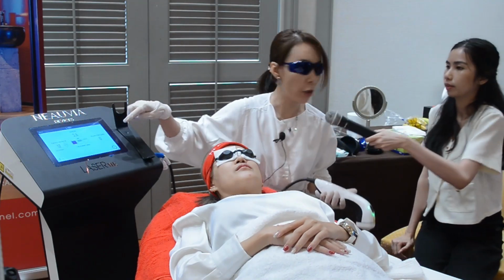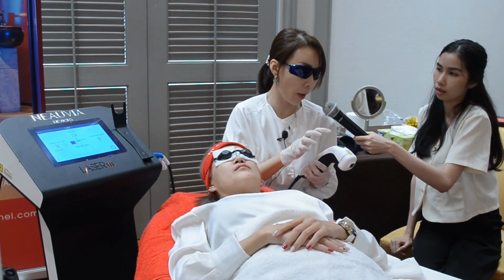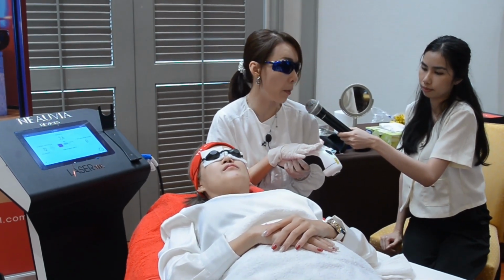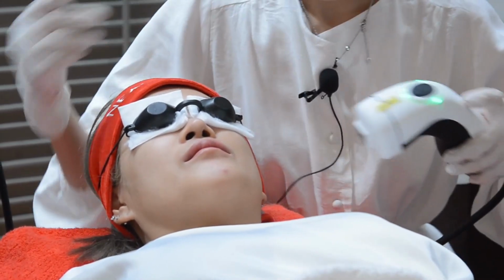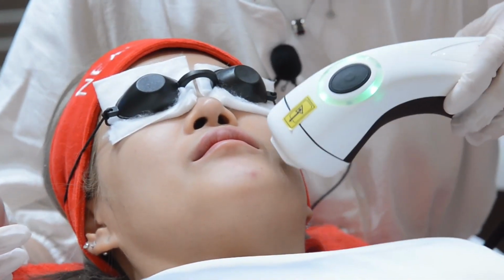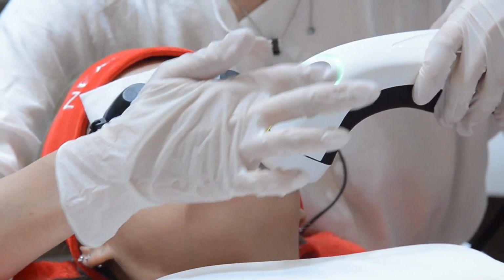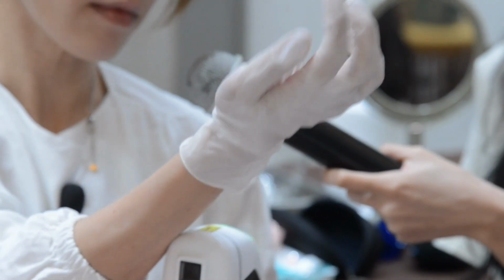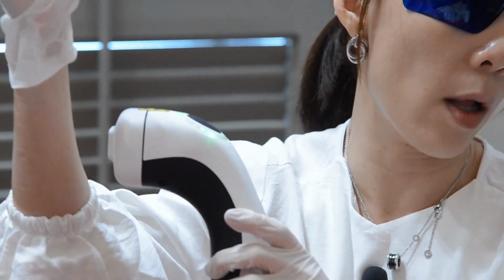Just now I pressed this button. You can see it's red. That means the handpiece is ready to be operated. And you can see from the screen here, there are 3 dots. This means the handpiece is on standby mode, ready for you to start. When we have full contact with the skin, you will see all the green dots lighted up. If there is any unevenness, this is considered not full contact, so you will not be able to shoot the laser at all.